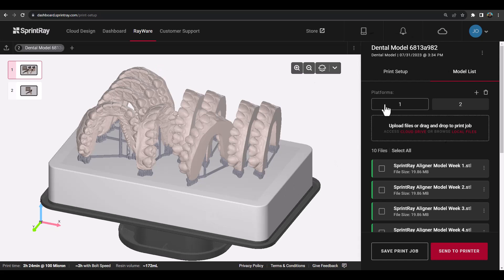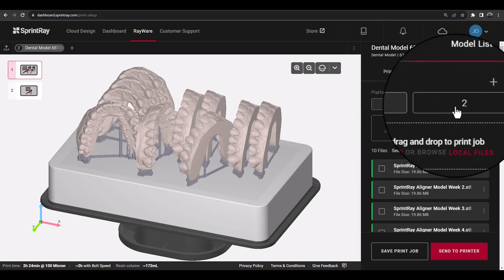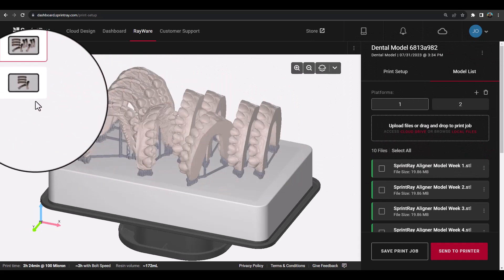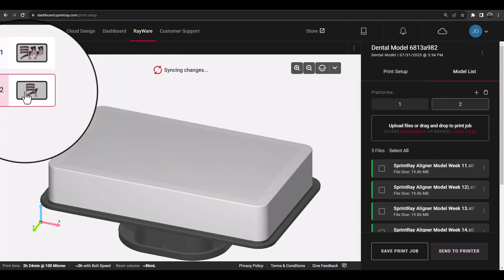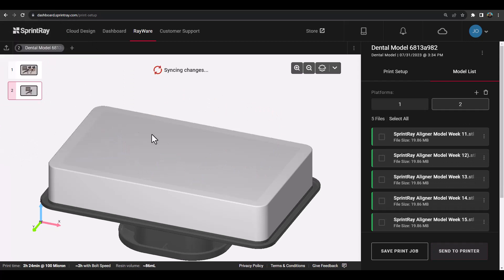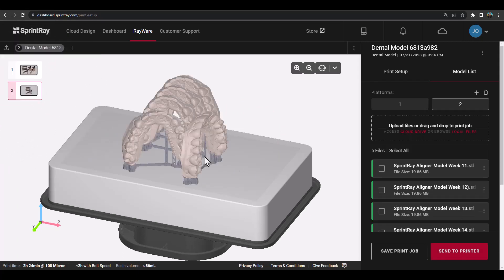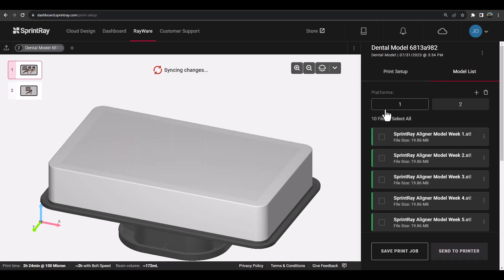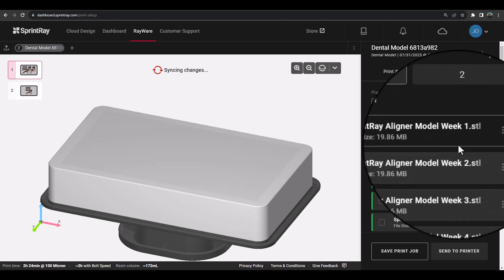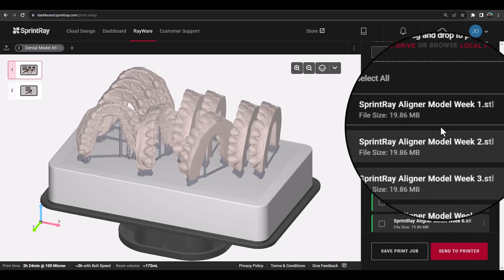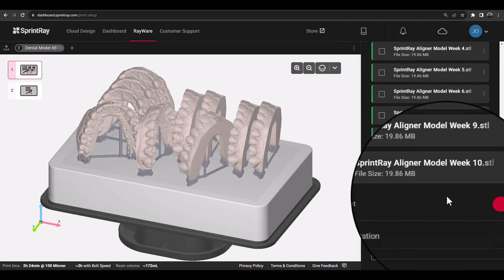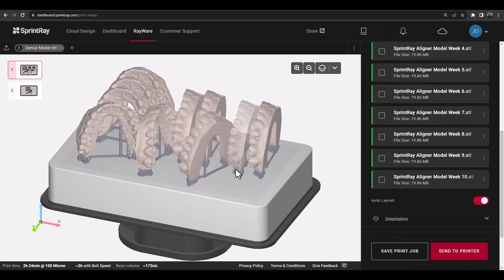The model list on the right-hand side will show the number of platforms, and small pictures of the platform setup will be shown in the upper left-hand corner, which you can click on to easily switch between platforms at any time. As you can see, Rayware Cloud has automatically sorted the aligner models in chronological order based on the week number provided in the file name.